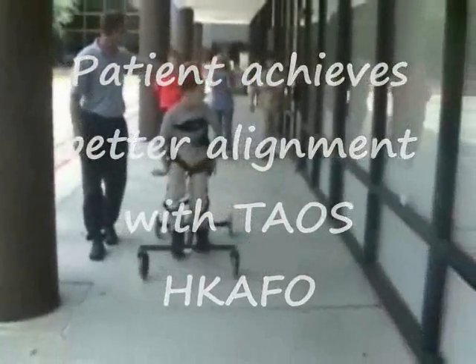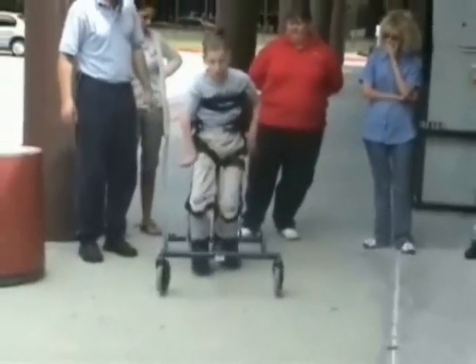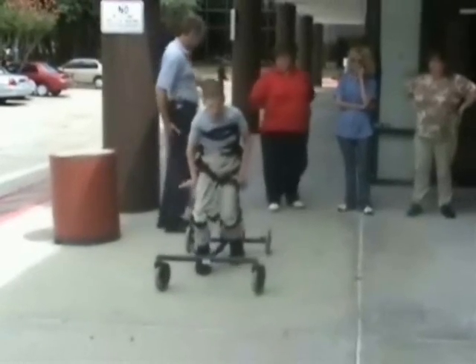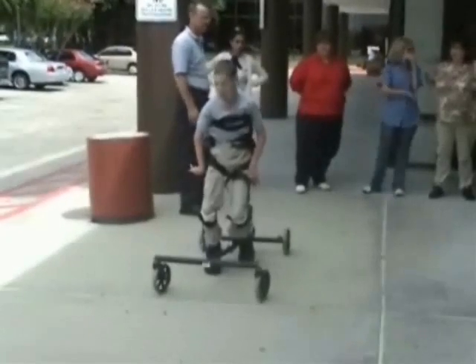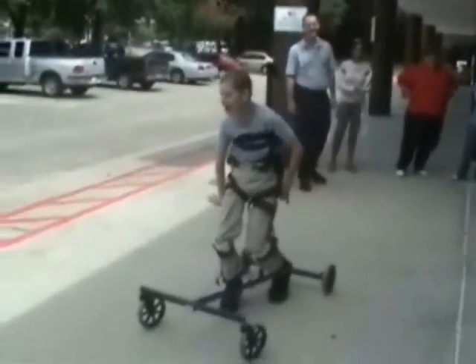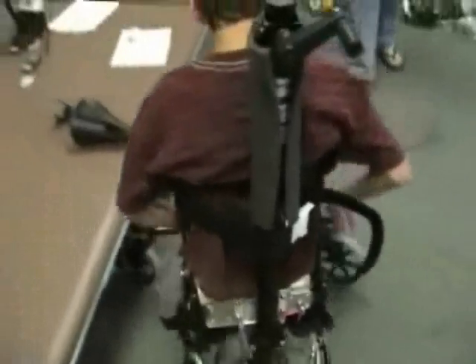This particular patient has some knee contractures, so that's another challenge to overcome. It's not an optimal situation, but it can be done with certain patients who have knee contractures up to a certain angle. You can see this patient using the reciprocating gait cables that attach at the ankle and knee, and only allow one foot to advance while the other goes behind. You can see the cables being used here at the knee and ankle.